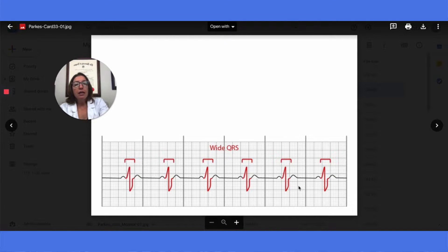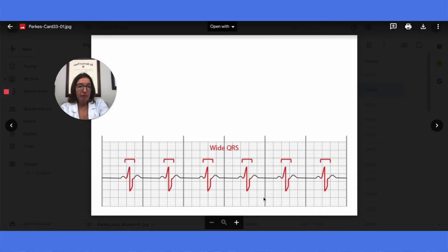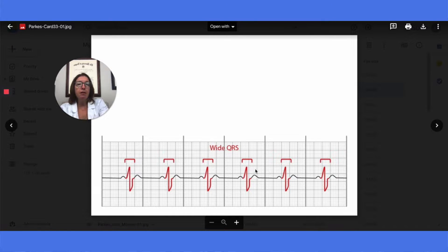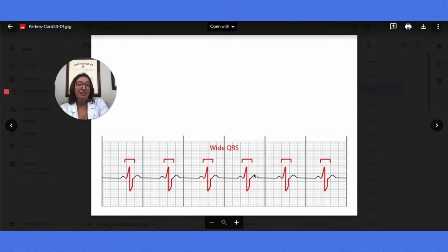If a patient has a bundle branch block but is asymptomatic, it often doesn't require treatment. However, if the patient has a bundle branch block that is symptomatic, we can treat that with either a pacemaker or cardiac resynchronization therapy, or CRT. Here you can see in the EKG strip that we definitely have a consistent bundle branch block because that QRS complex is abnormally wide.